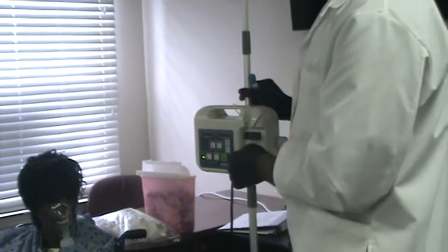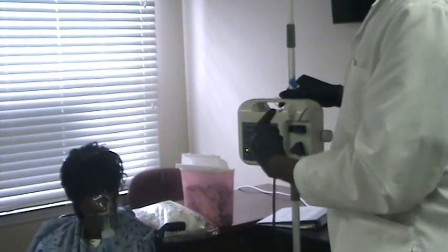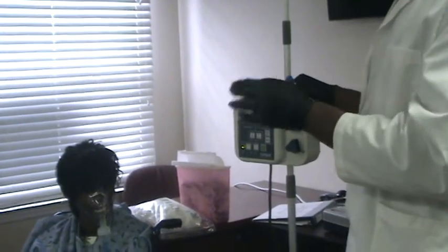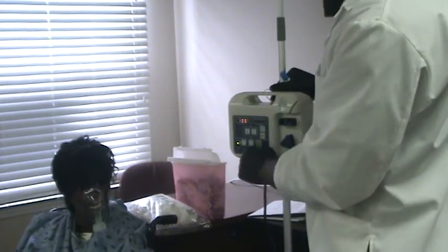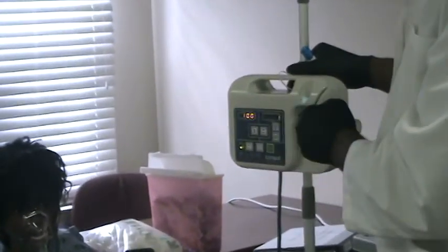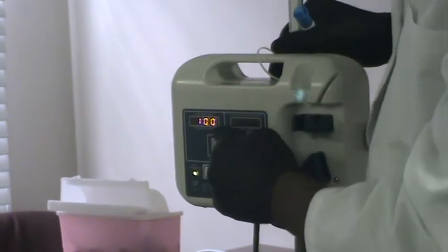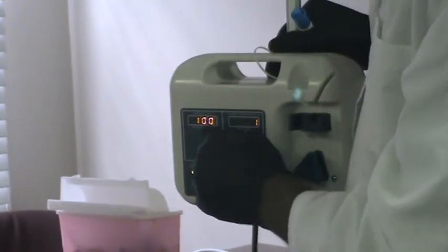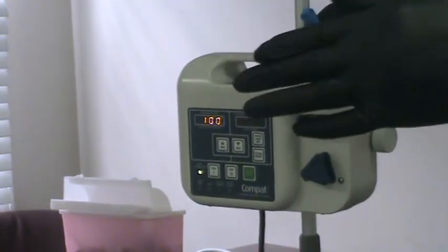Okay, it's on. There's a battery that charges to keep the memory of what has been programmed. So there are two windows, two screens here that you need to understand. One screen is used to set up the dose per hour.